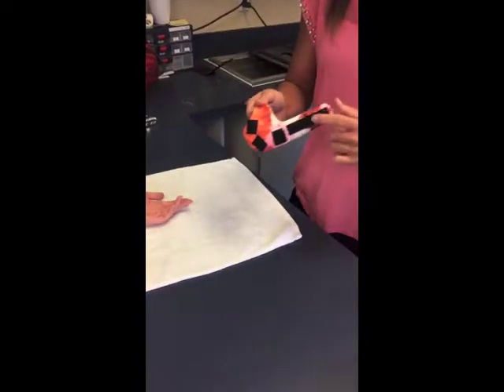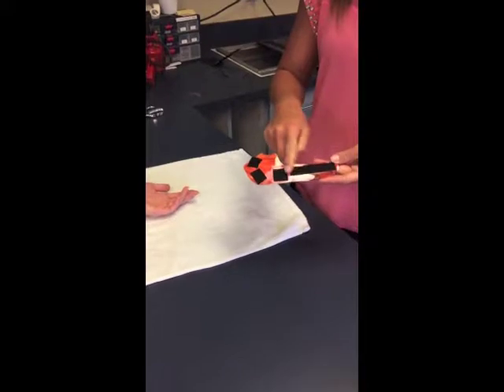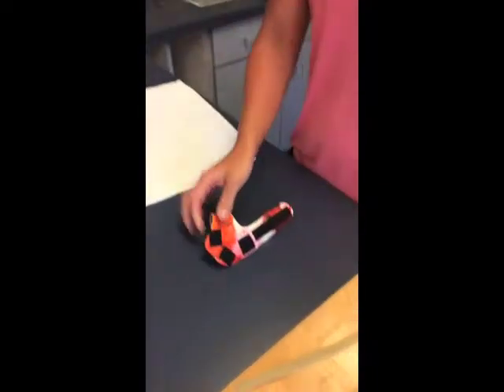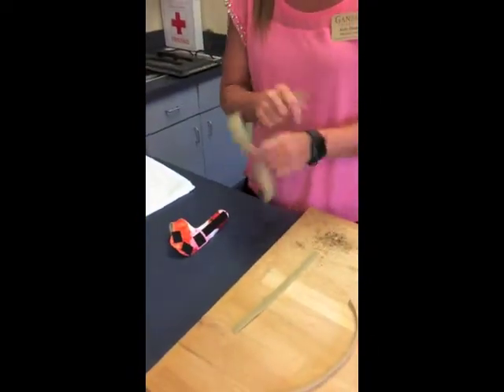Now I put hook velcro along the top part where the fingers are going to be, and then a piece here and here for the thumb area, and then two at the bottom for the wrist. Now I'm going to use the soft velcro to anchor it around.